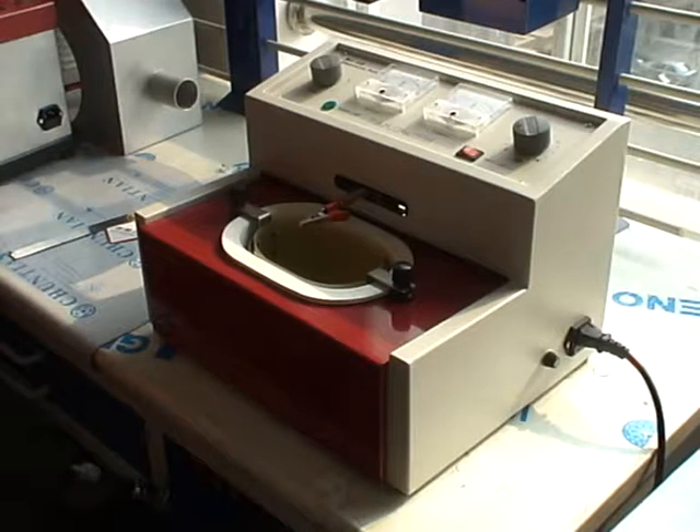This is the demonstration video of the AXDE2 electrolytic polisher. In this video I will show you how to use this machine. Sometimes you might encounter some problems and I will tell you how to solve them. Now let's begin.